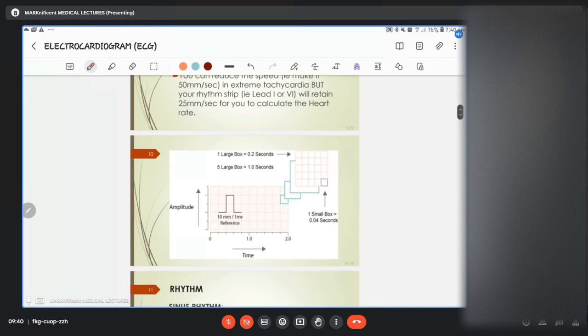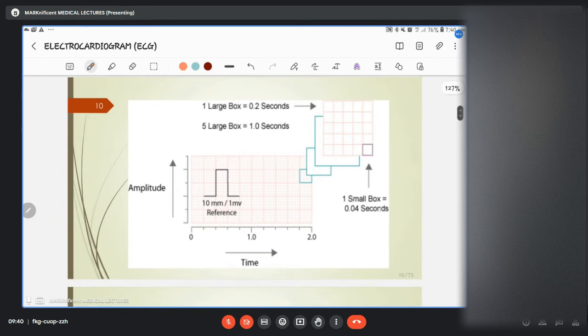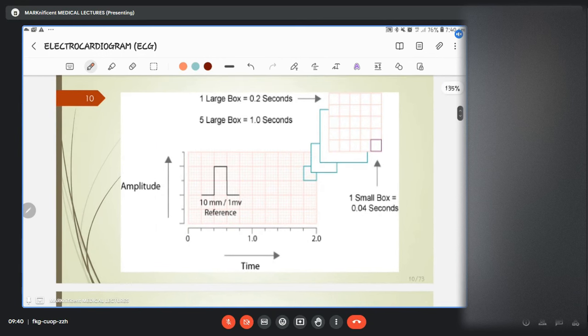So this is the box here. This is the picture, I mean. This is a small box. You know, this whole box here having 5 horizontal, 5 vertical is what is being shown here. And on this small one, it is written here that it is 0.04. So on each of these small boxes inside here, you have 0.04, 0.04.